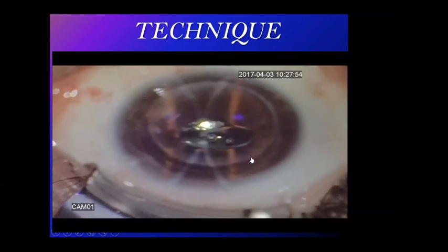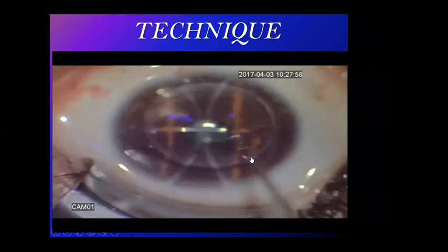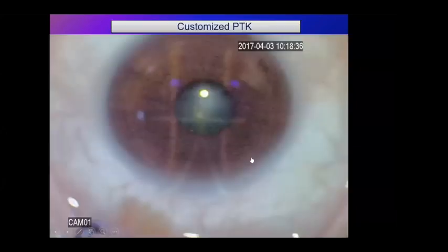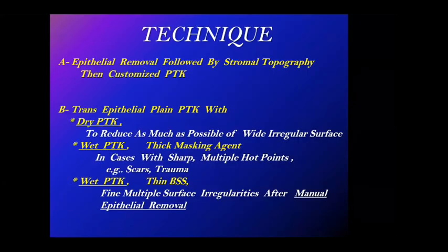So we can make it 3 millimeter, for example? Sometimes I do that in corneal scarring. Mm-hmm. Okay. Now I'll just go back to the question. Another question. No, I went back.